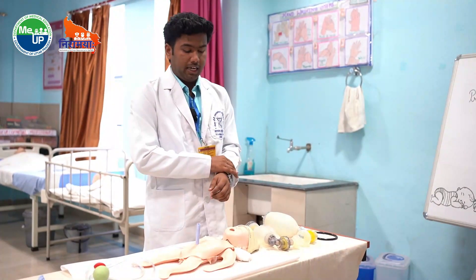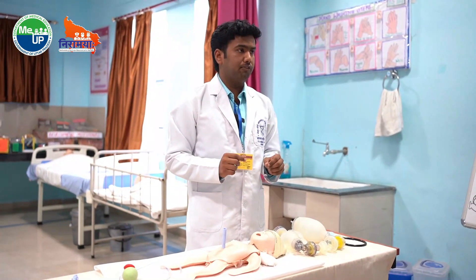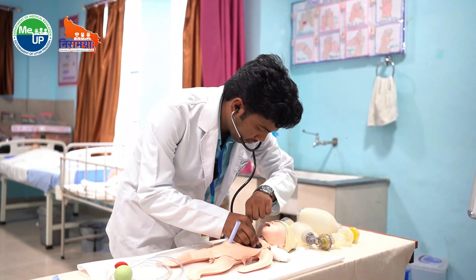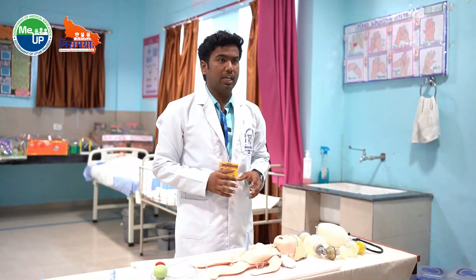After that, we will again assess the heart rate and breathing for 6 seconds. We will also connect the baby to the pulse oximeter to check the heart rate.